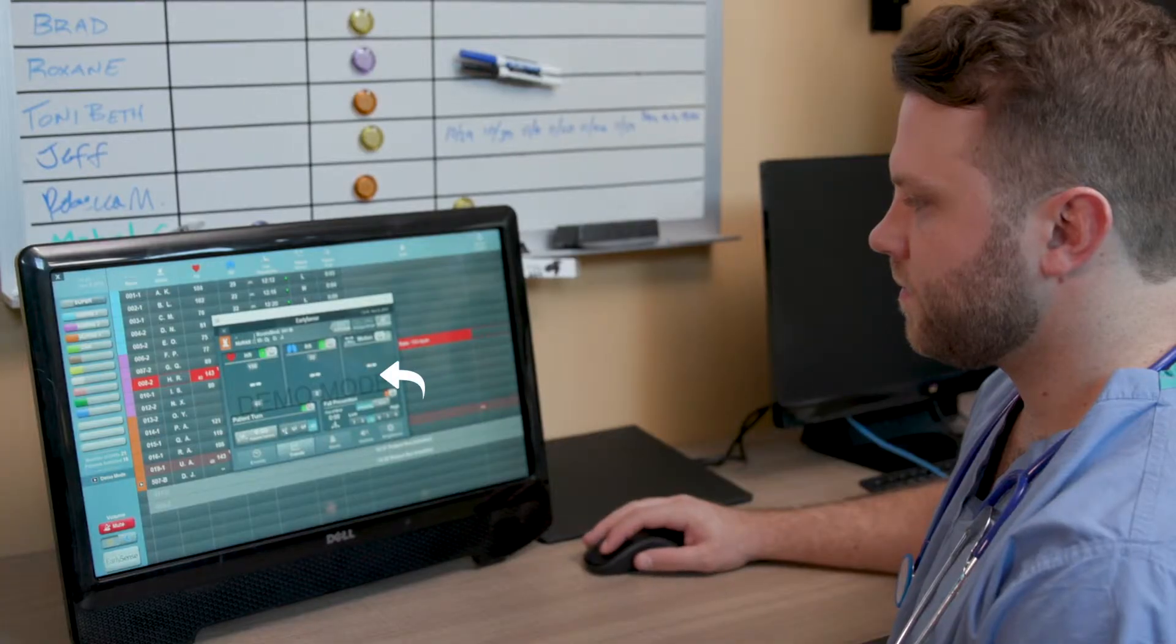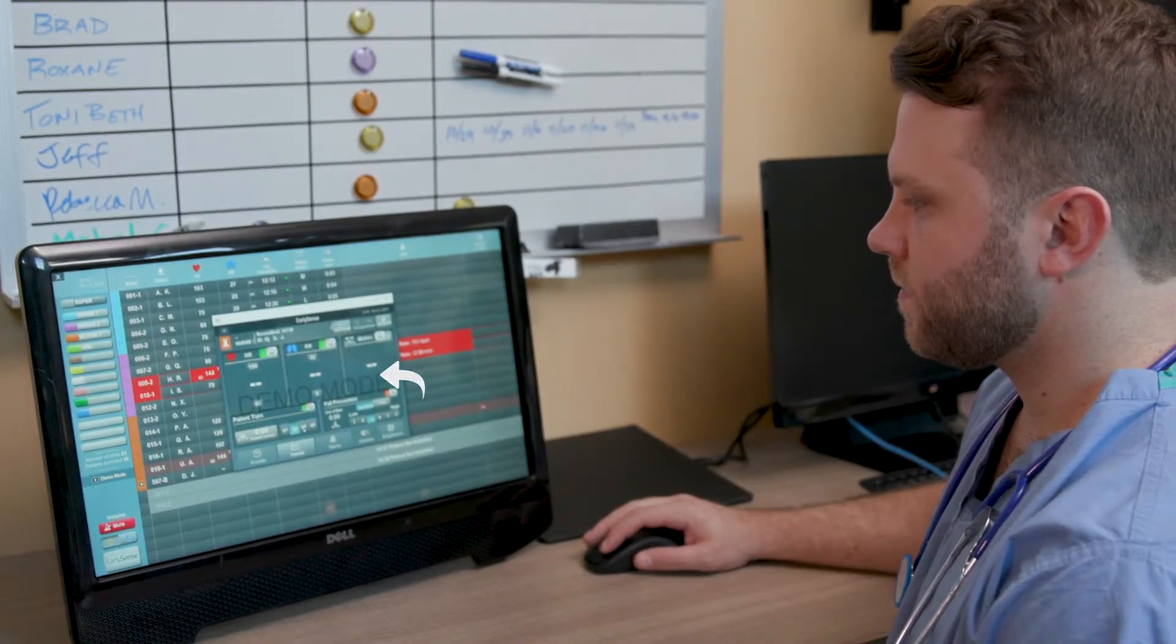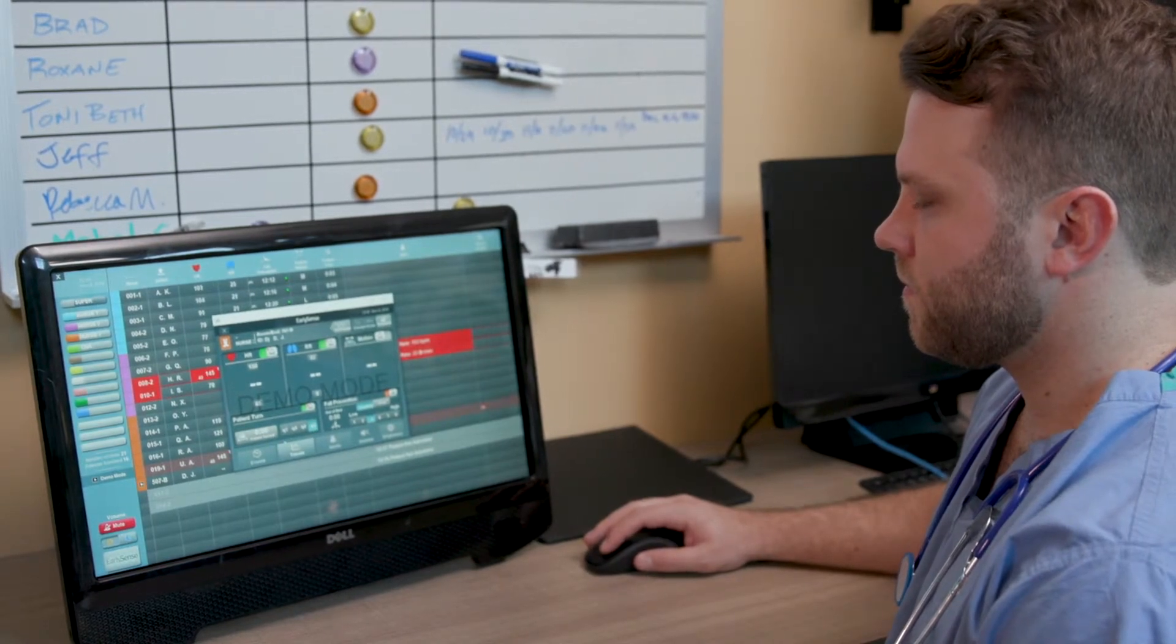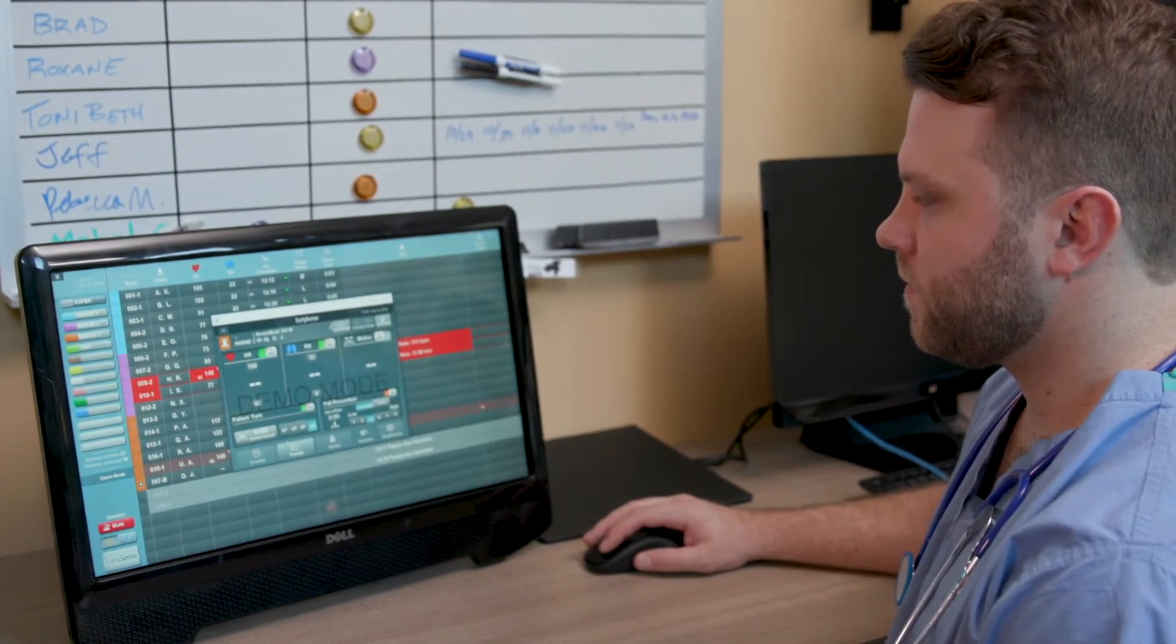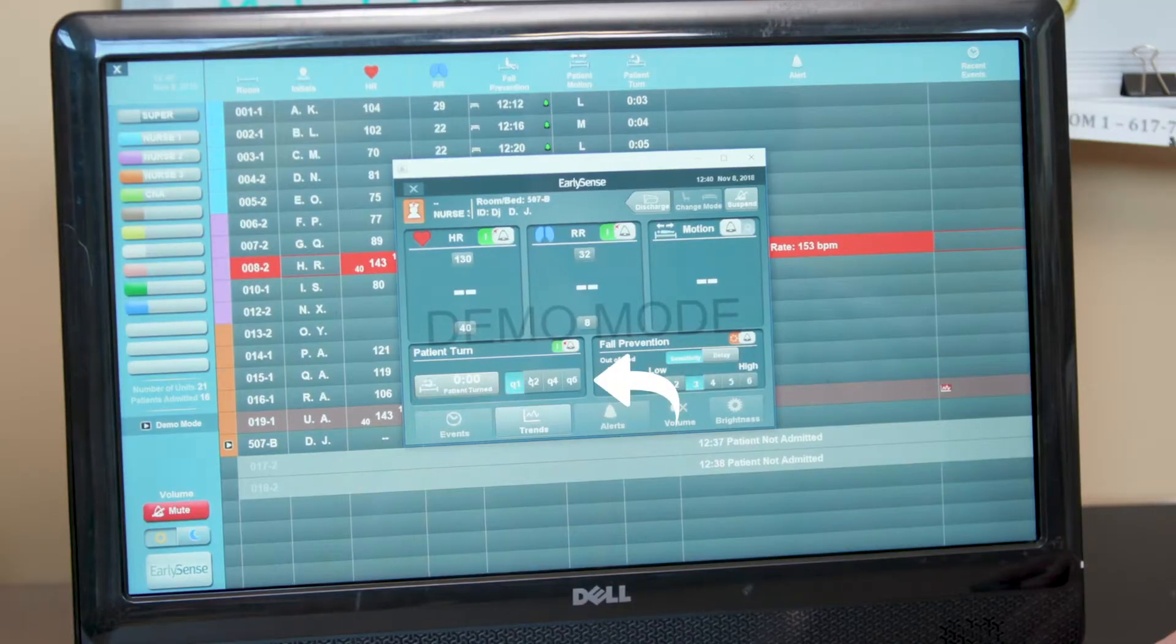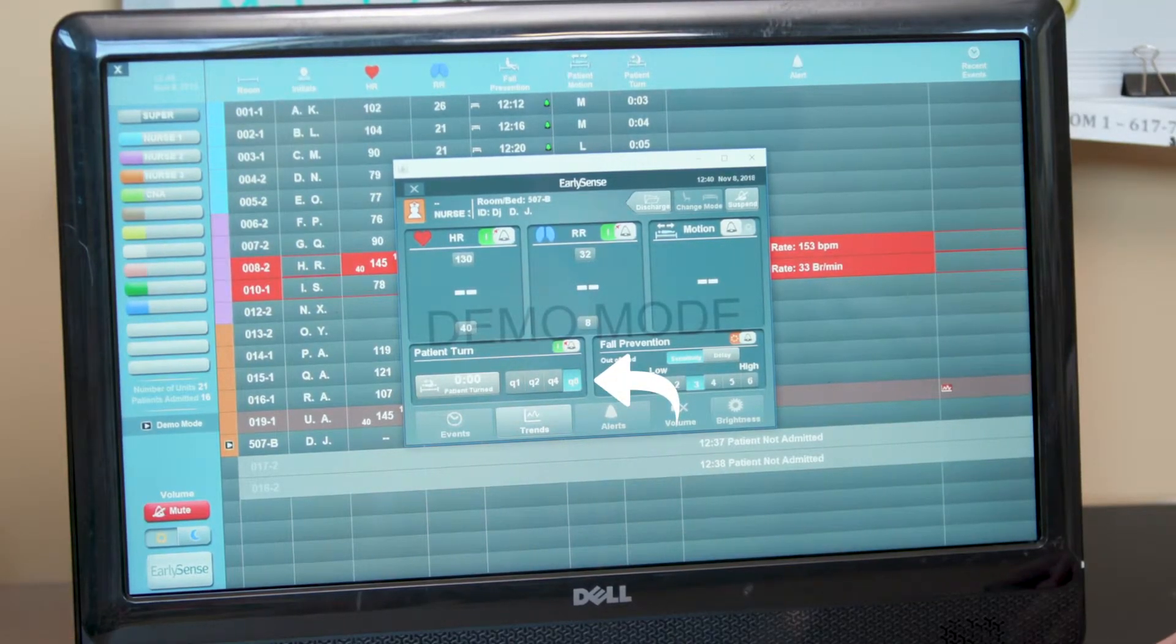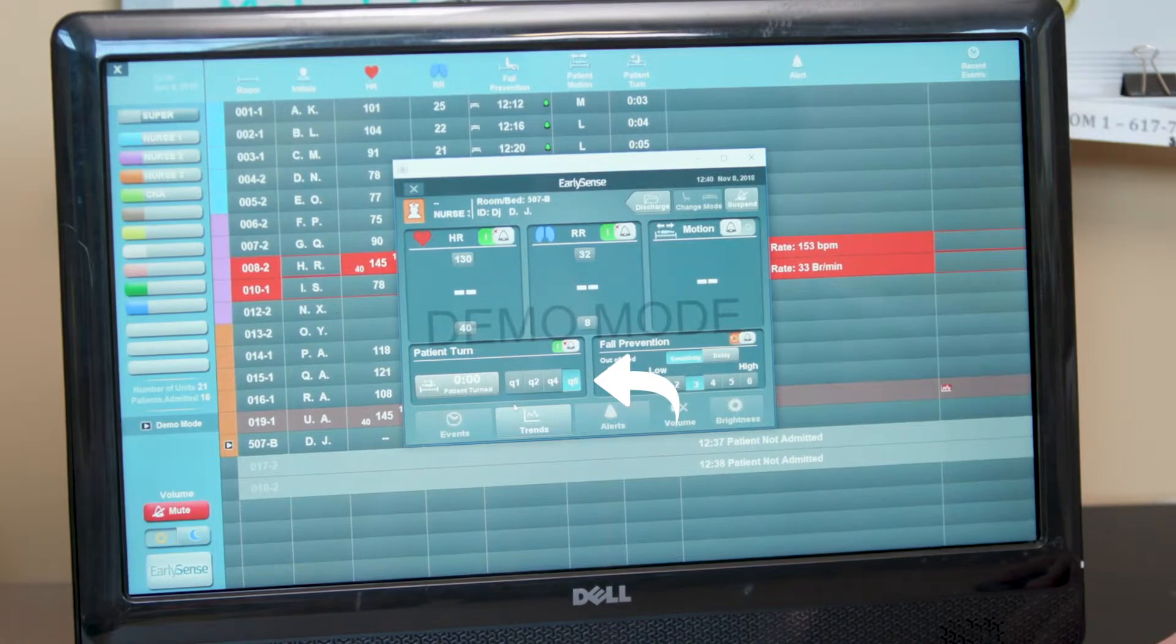You can choose the proper time interval for the reminder according to your facility's recommended protocol. To change the time interval between turn reminders, select the Q button in the Patient Turn section of the Patient's Profile on the CDS.